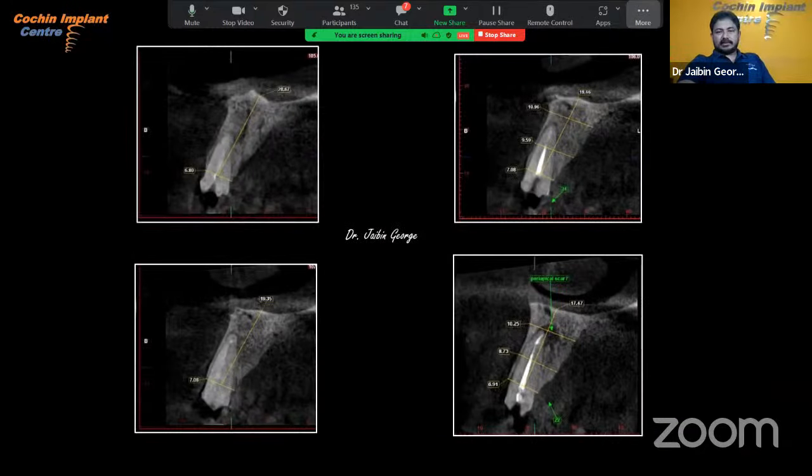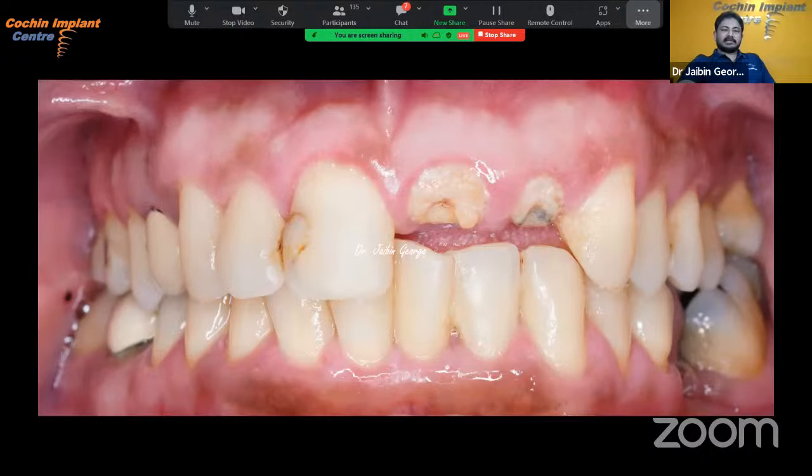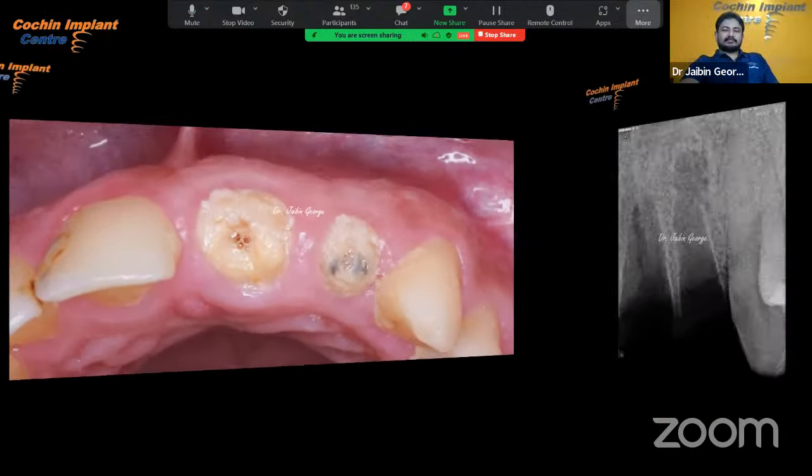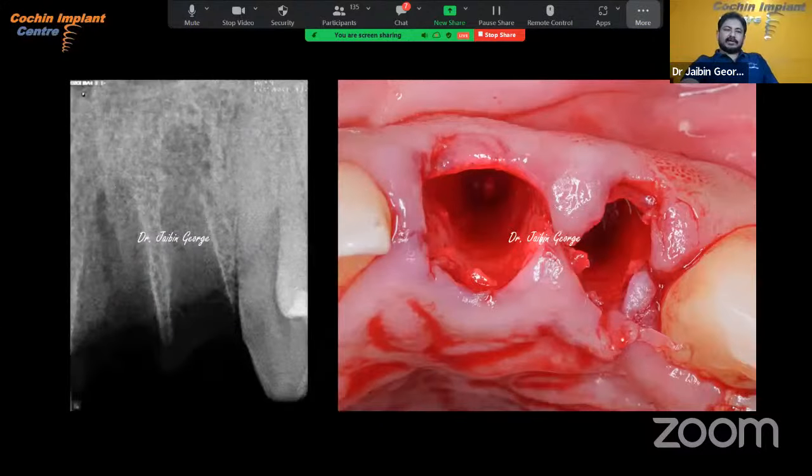This is the CBCT cross section of those teeth. You can see the radiolucency at the lateral incisor apex. These are the pre-op photographs of that case. Occlusal view. The teeth were extracted in a less traumatic way. We cannot call it an atraumatic extraction because all extractions are traumatic. Here, it is a less traumatic extraction. I have used a magnetic mallet in this case also.